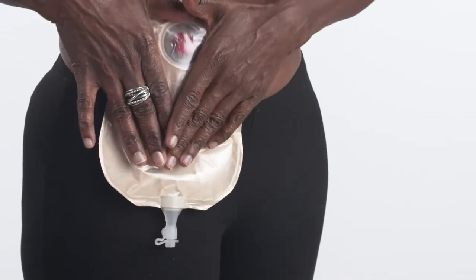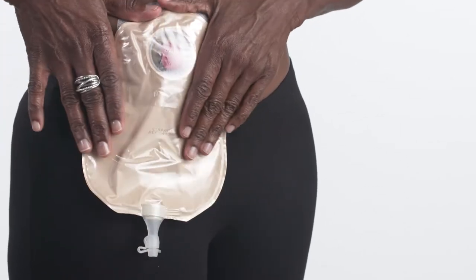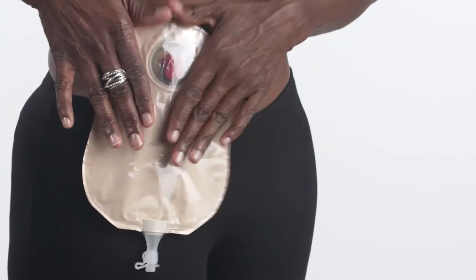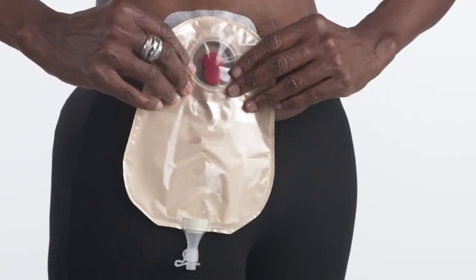Double check that the flanges are snapped securely together by pressing all the way around them a second time. Press and hold your hands in place for at least 30 seconds to ensure good adhesion.